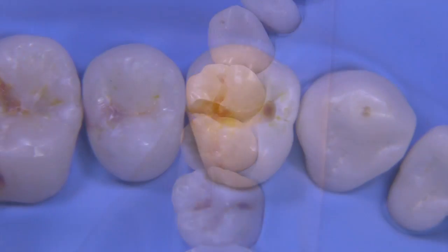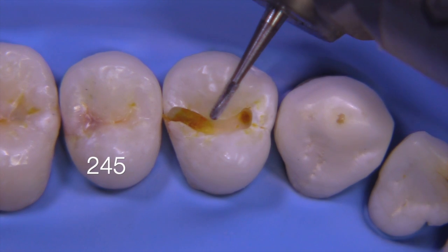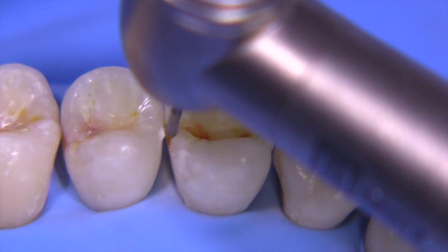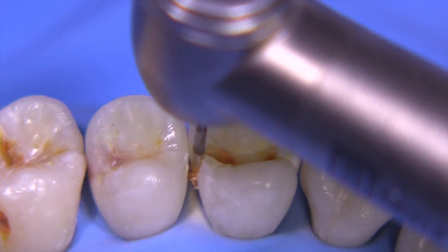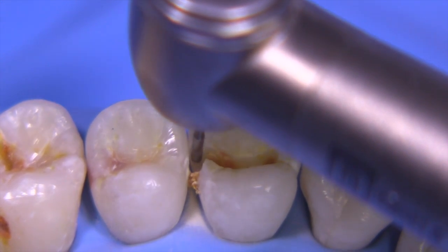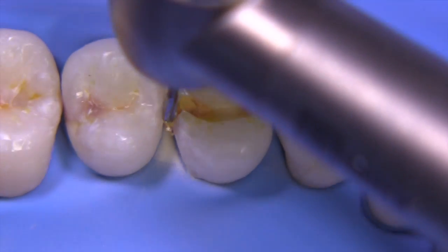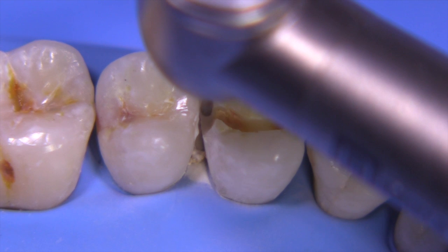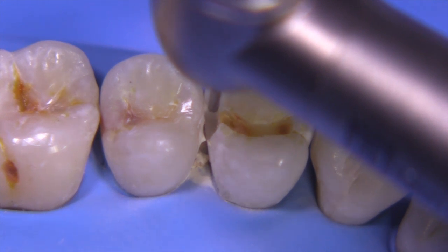Now we're going to switch over to the 245 burr because we need a longer burr to reach down to the gingival aspect of the proximal box. This burr is only 0.8 millimeters wide, so you can keep the burr away from the adjacent tooth and not worry about going too deep axially. You want to focus just on the box and not on the caries — don't let the caries distract you from the geometric configuration you're trying to create. We're going to deal with caries in the fifth step of GV Black's steps of cavity preparation, not in the first step.